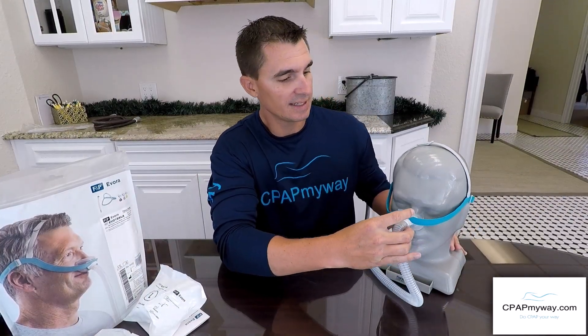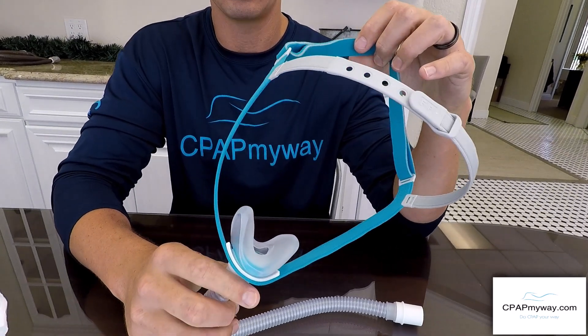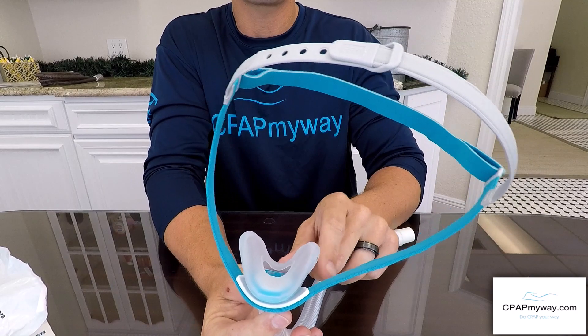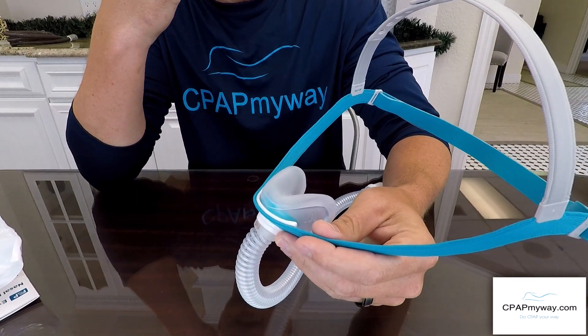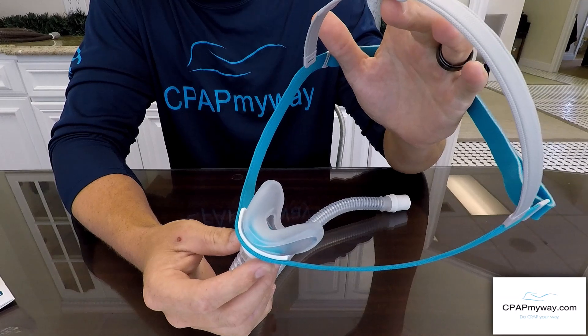So this is the Evora from Fisher & Paykel — a really cool new mask we're pretty excited about because it is very unique. First and foremost, you'll notice it's a cradle design so it fits underneath the nose, which keeps from any irritation across the bridge of the nose. You're seeing a lot more masks like this in the market.